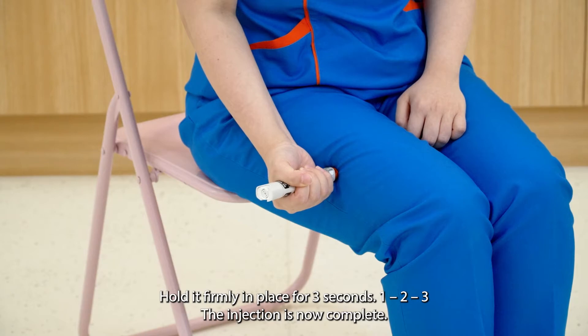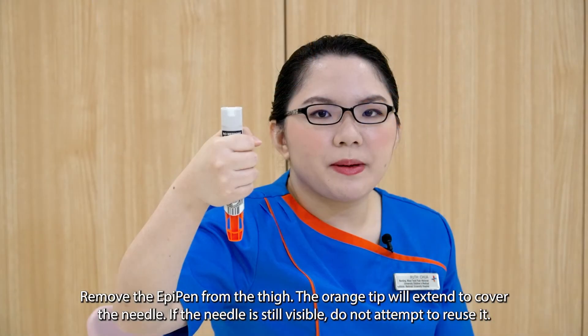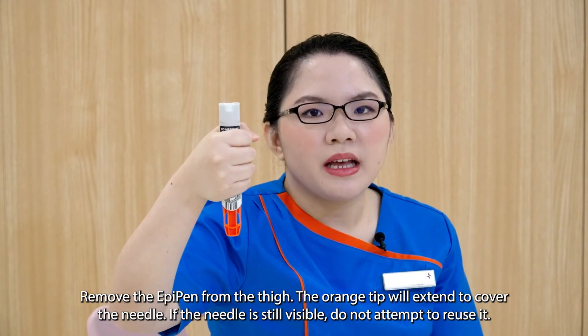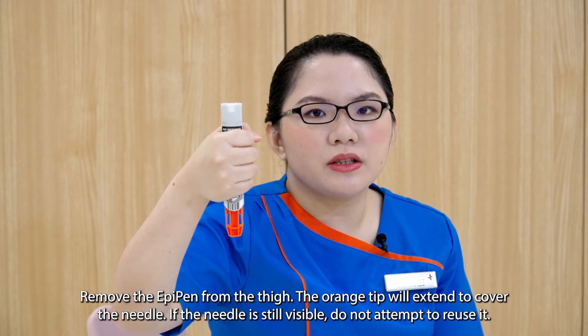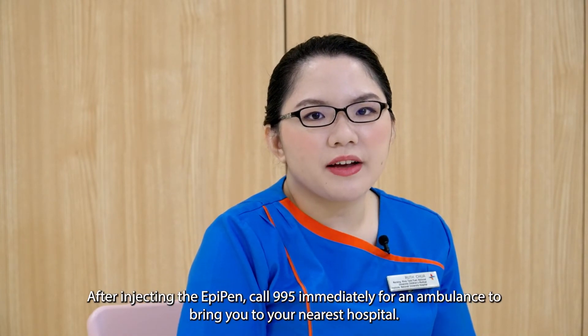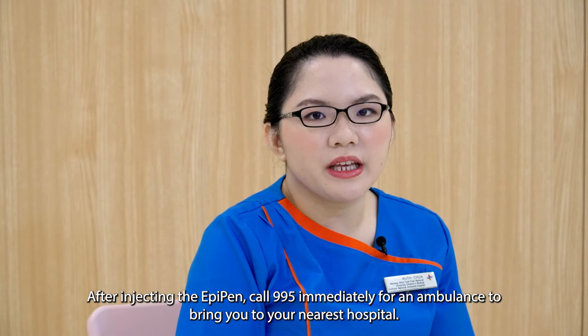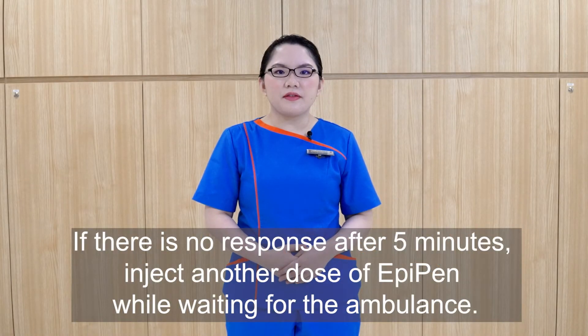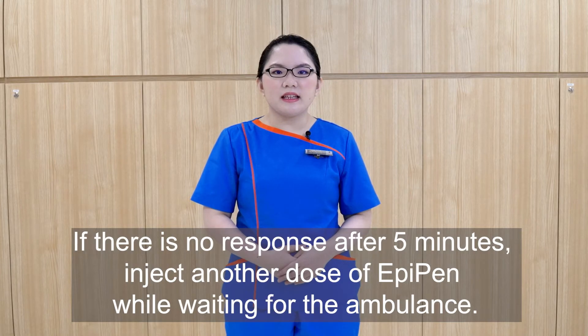The injection is now complete. Remove the EpiPen from the thigh. The orange tip will extend to cover the needle. If the needle is still visible, do not attempt to use it. After injecting the EpiPen, call 995 immediately for an ambulance to bring you to the nearest hospital. If there is no response after five minutes, inject another dose of EpiPen while waiting for the ambulance.